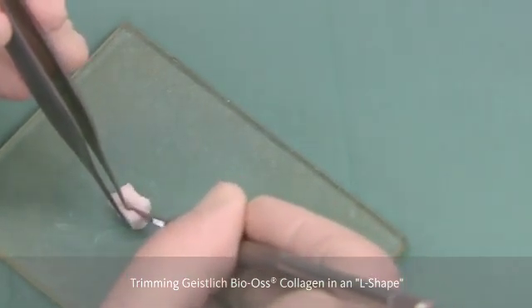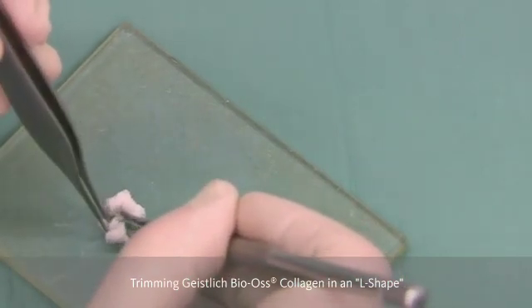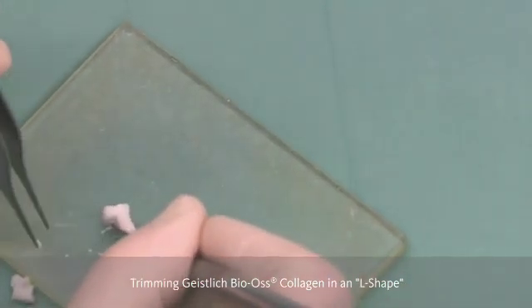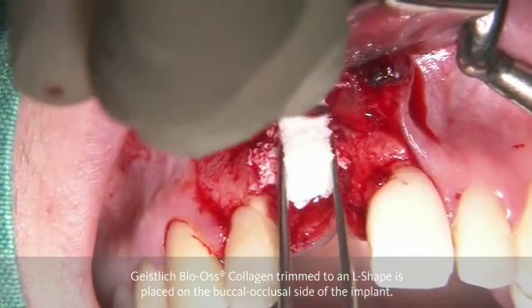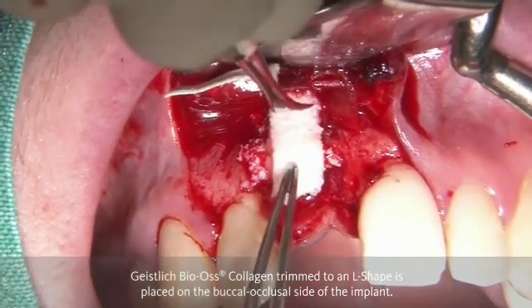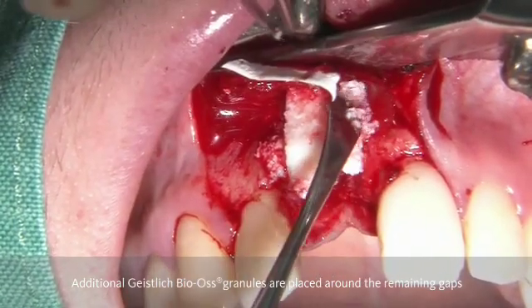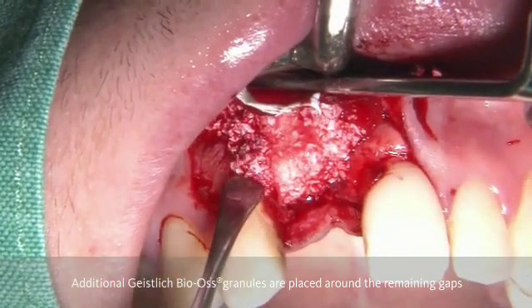This L serves different aims. On the one hand, we would like to have more contour on the buccal aspect, mimicking the root prominence. On the other hand, we would like to support the soft tissue in the vertical part, primarily for prosthetic reasons and for aesthetic reasons. So it is not meant that everything is going to turn into bone — the buccal part turns into bone, and the coronal part on top of the implant is primarily there to support the soft tissues.